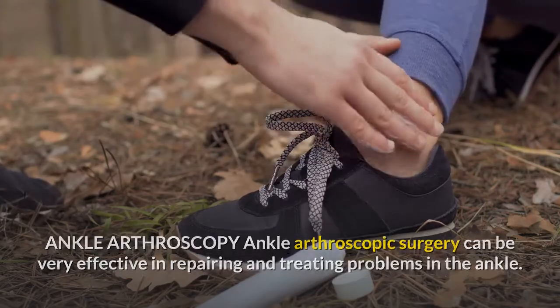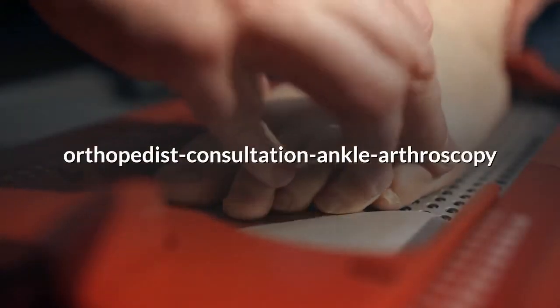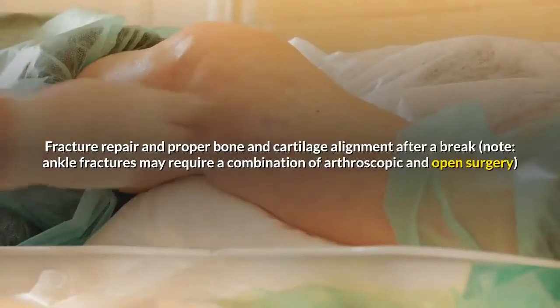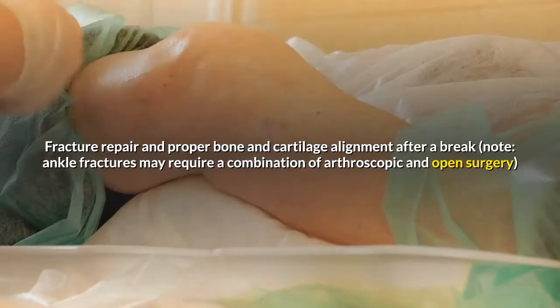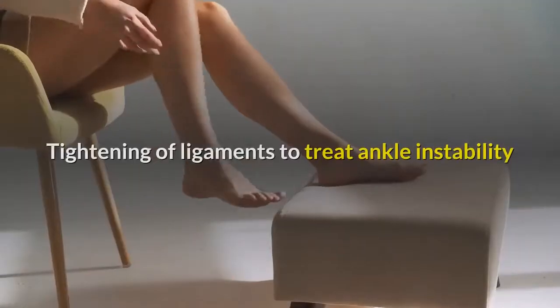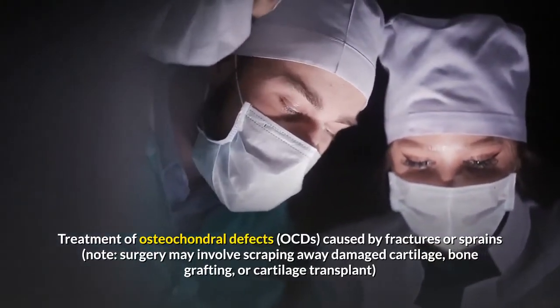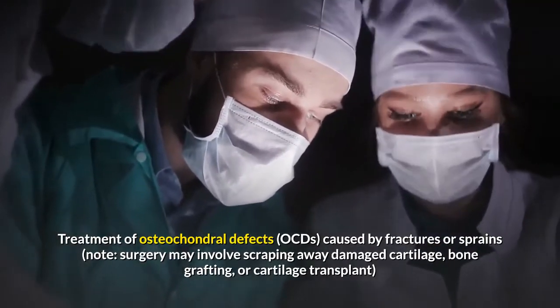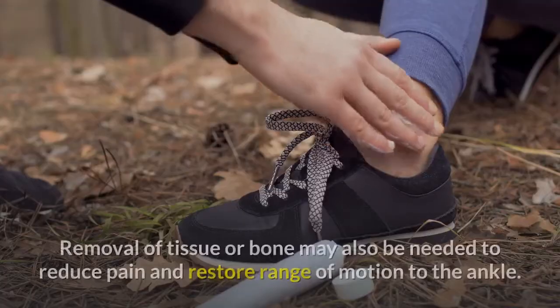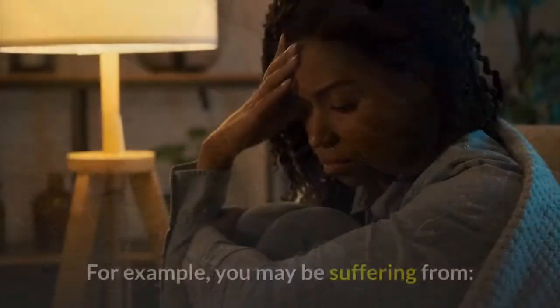Ankle arthroscopic surgery can be very effective in repairing and treating problems in the ankle. Frequently performed arthroscopic repairs to the ankle include: ankle fusion for end-stage arthritis, fracture repair and proper bone and cartilage alignment after a break (note: ankle fractures may require a combination of arthroscopic and open surgery), tightening of ligaments to treat ankle instability, and treatment of osteochondral defects (OCDs) caused by fractures or sprains. Surgery may involve scraping away damaged cartilage, bone grafting, or cartilage transplant.